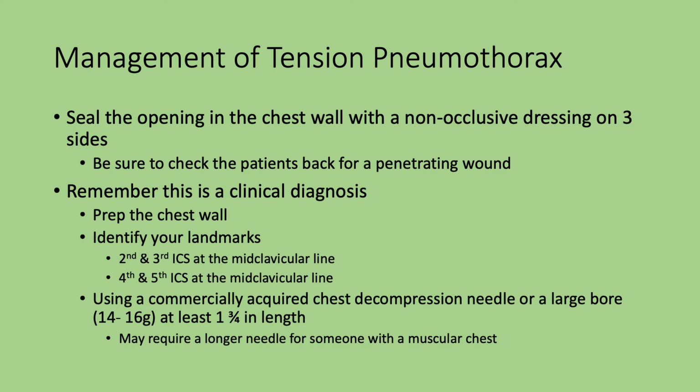Next thing is to identify your landmarks. The primary landmark is the second and third intercostal space at the midclavicular line, but you can also use the fourth and fifth intercostal space at the midclavicular line.